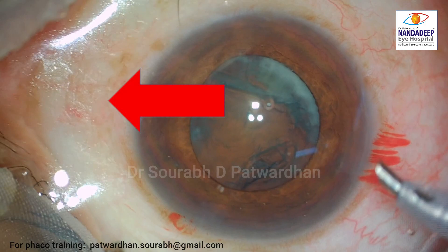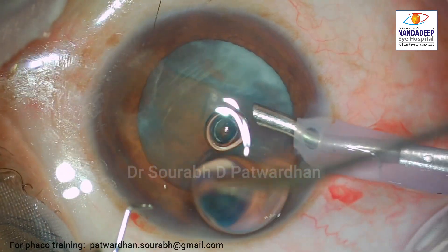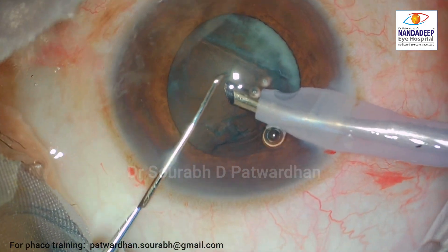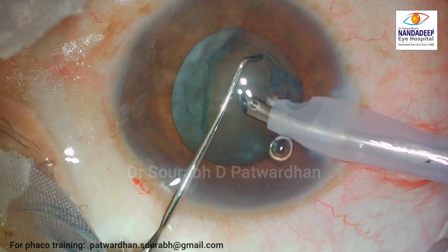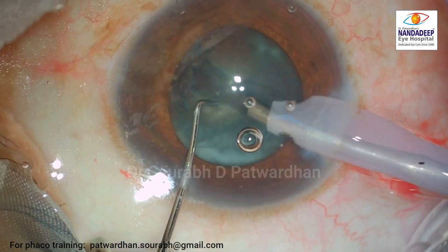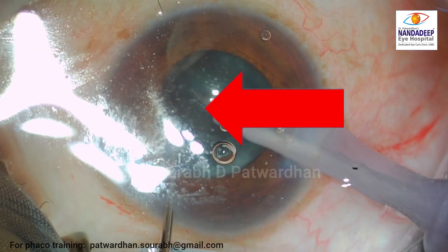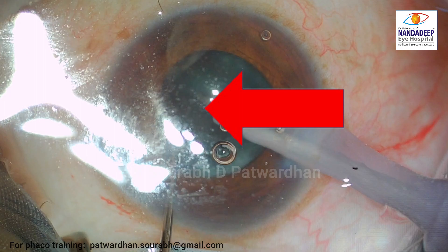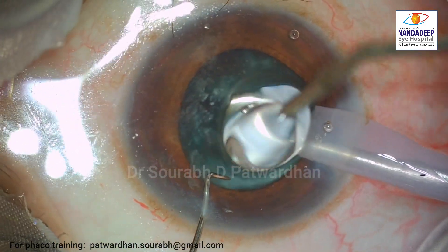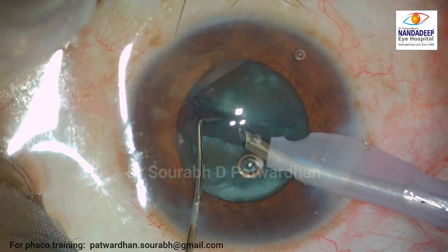As I start the surgery, I can see that there are some oily droplets over the ocular surface, floating over the fluid. I start the surgery anyway because it's not hampering the view. But as I continue, more and more of these oily-looking droplets — a kind of opacity — start disturbing my vision. There is some water pooling, and over that, these debris which look like oily deposits are disturbing. So I decided to put some 2% HPMC to push that away.